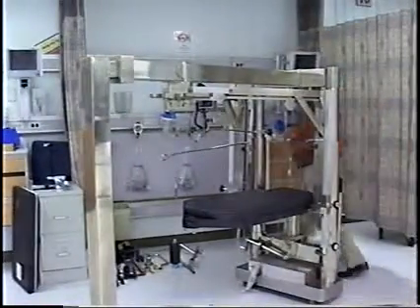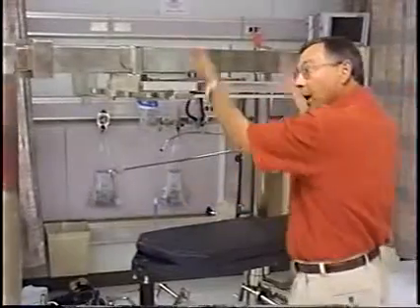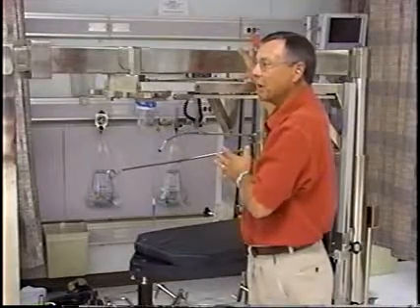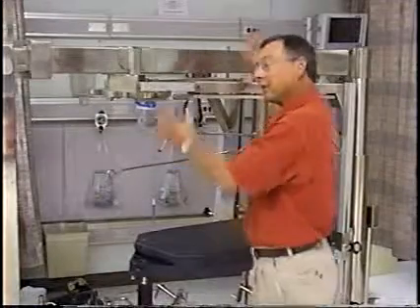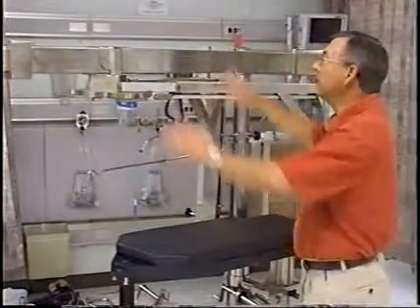The first thing you have to do is to determine which hip the doc's going to be doing. If it's the left hip, you need to make sure that the table is positioned with the surgical lights on the left side, because once we pump this up, you can't move the lights over the frame. And nothing is going to upset that surgeon more than to come in at 2:30 in the morning and you've got the lights over here and he's working on a right hip. So make sure you read the chart, make sure you know it's a left hip, make sure the lights are over here.